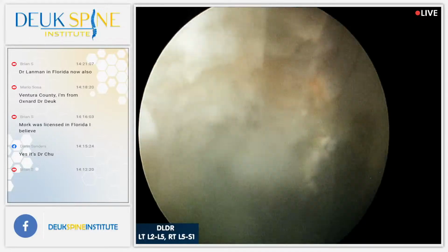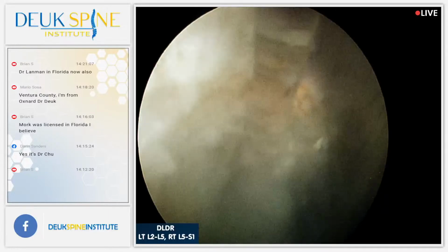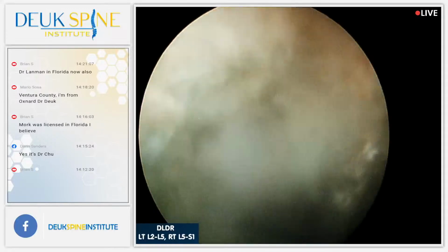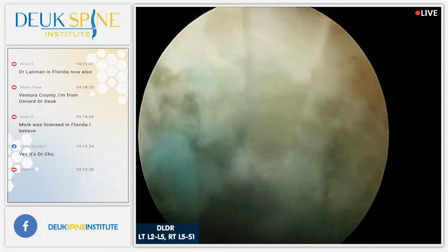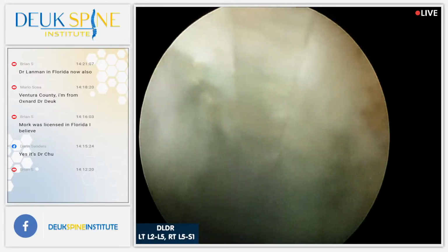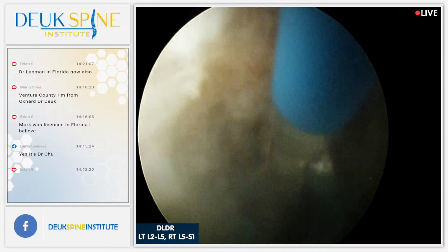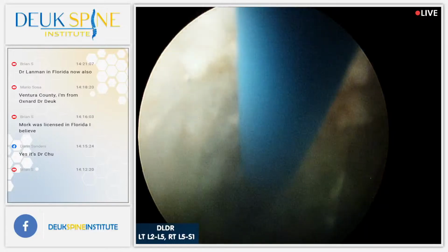The clear thing is the laser fiber. It's glass. It transmits laser energy through the center of it to the end, where the tip of it is where the laser energy comes out and it breaks up tissue. I've talked about this before. I might as well talk about it again. The way laser energy causes its therapeutic medical effect is it basically is high frequency, high energy, absorbed by molecules, mostly proteins, that once they absorb that energy, they literally shake and vibrate so hard that they break apart.